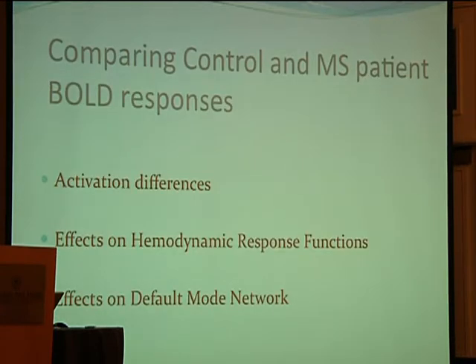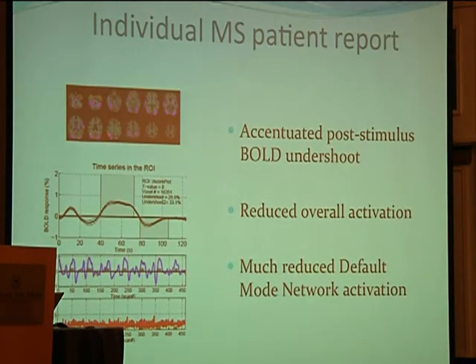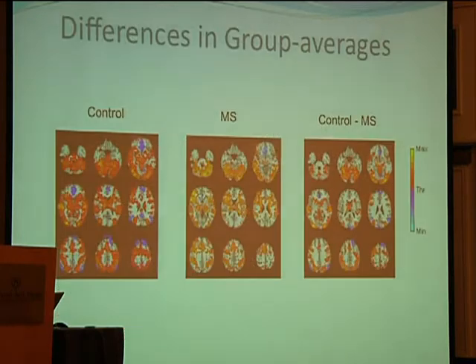When you look at the first MS patients before angioplasty procedure, one of the things which popped immediately out was this larger undershoot in some patients, not all of them. But this was really salient, so we thought maybe it can be used as a diagnostic feature.